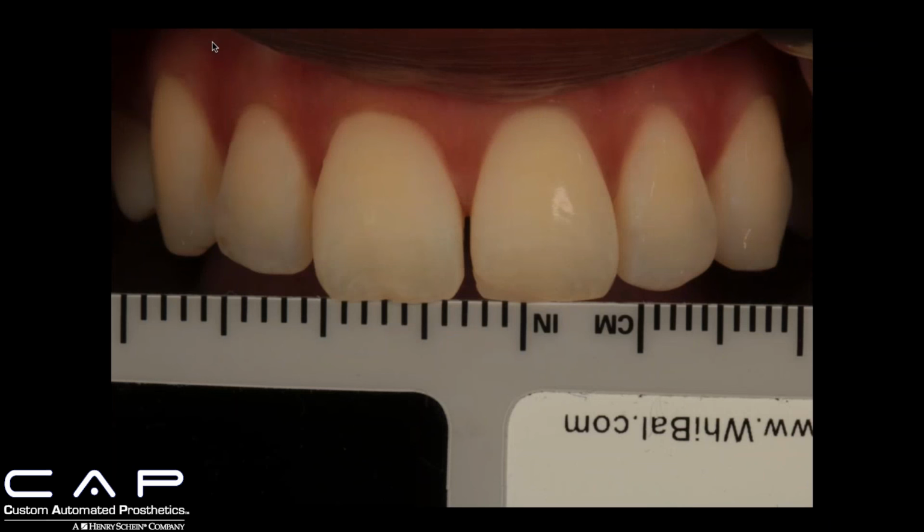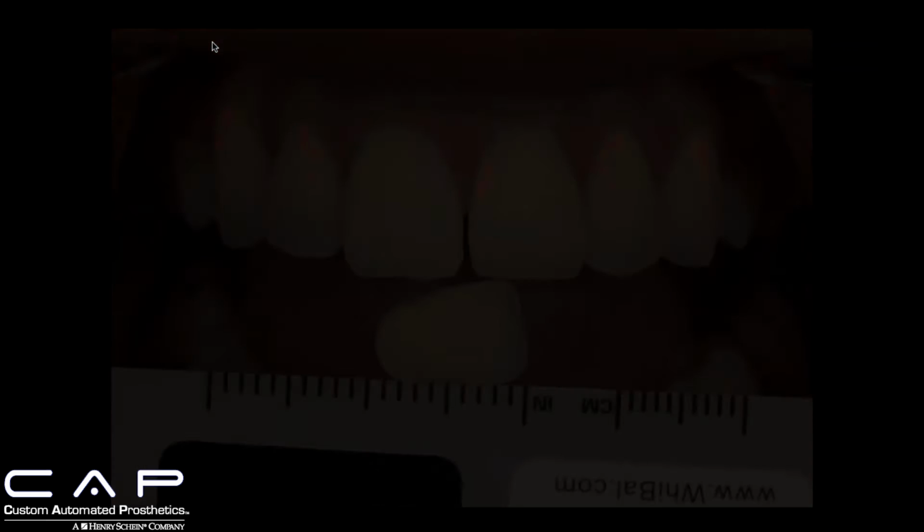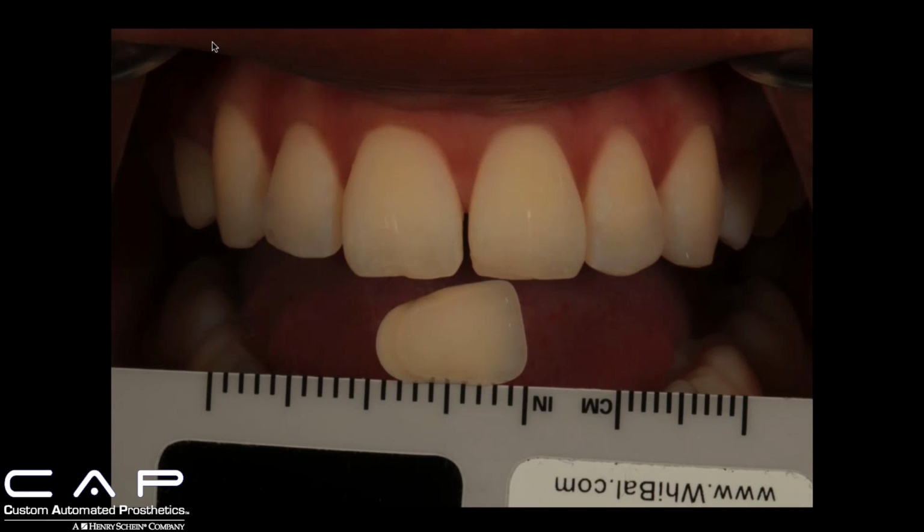So let me go back to that. To get this photograph correctly, you want to place the gray card directly under the incisal edge of the teeth, and that way it's in focus with the dentition. And I took this with the polarized, so I'm not dealing with specular reflection. I'm getting a very neutral gray flat effect, and I don't have to worry about light and specular reflection affecting my white balance.